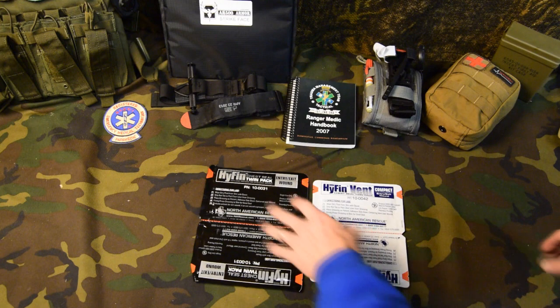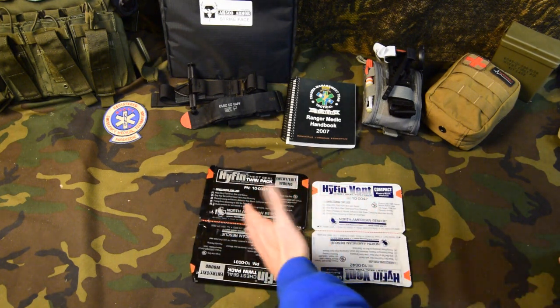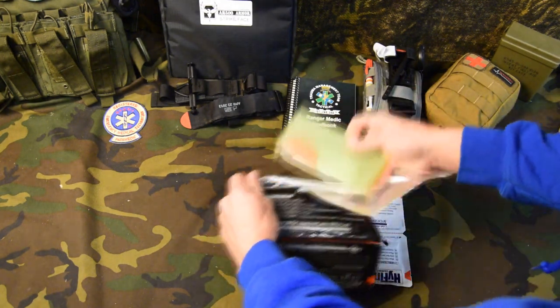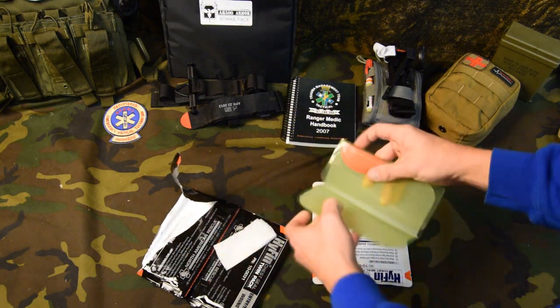For you guys that are curious, I'll open up. This is the non-vented, this is the vented, so I can show you the difference of these two different versions of the Hyfin here. You pull the red tab, and this opens up. Got a little sponge for blood.